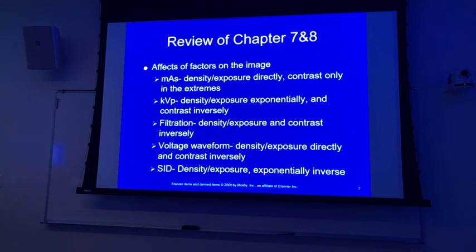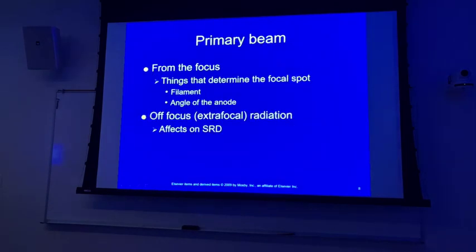Filtration and voltage waveform both do as well, but when's the last time you selected single phase versus three phase on your machine? Never. You can't do it, right? You've got to have two different types of machines. And filtration, you just don't change filtration that much.